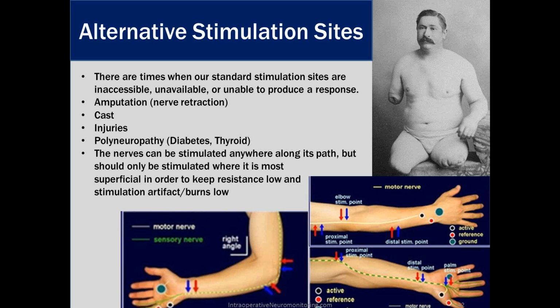If we look at the radial nerve, the easiest way to stimulate it is in the forearm area here, where it's pretty superficial, but you can also come more proximal, especially if you're up by the deltoid in the tricep area, that little gap where the radial nerve runs.